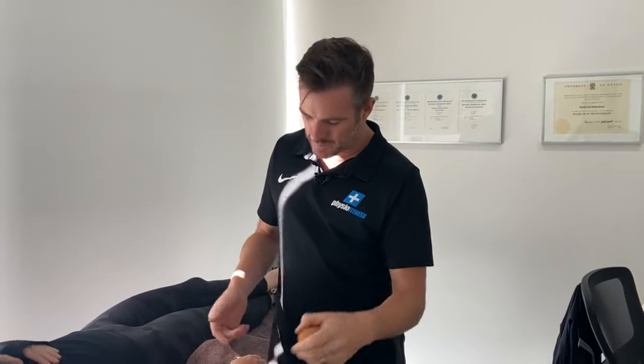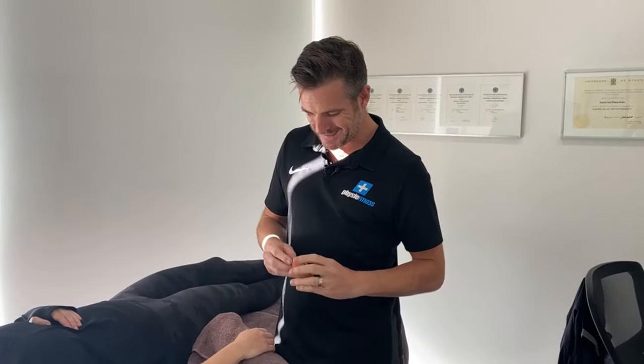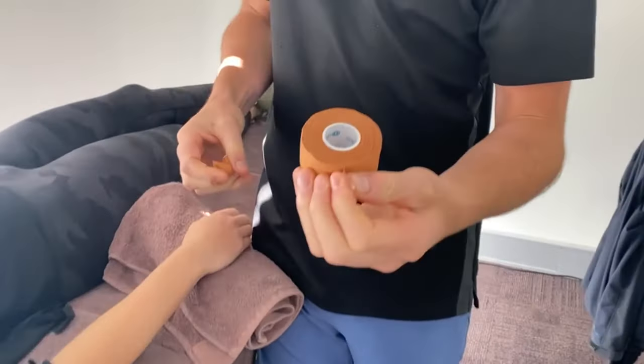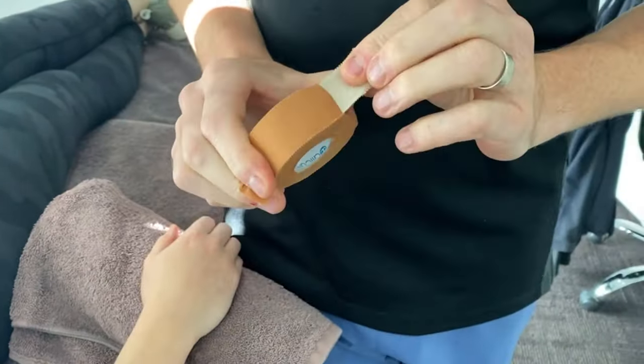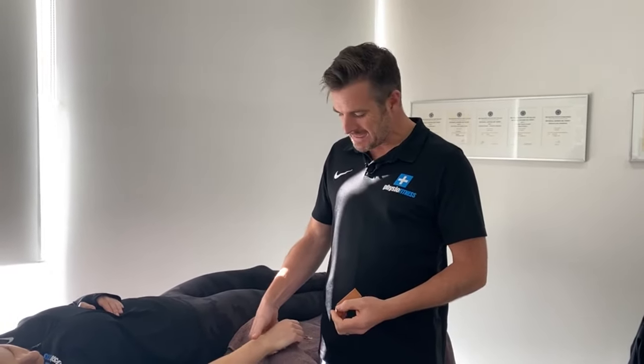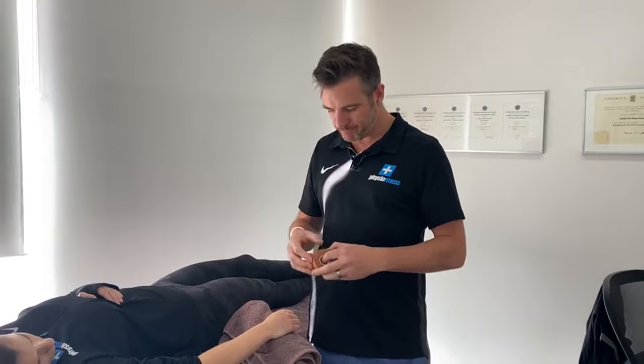We'll start with thumb tape — we call it thumb tape because we use it for thumbs, but it is 25mm tape, not the 38mm wide tape you use for ankles and knees. Make sure it is tearable tape with a serrated edge. This is zinc oxide tape, so it's really sticky and good, but some skins don't like it. If taping for an extended period like three or four days, put underwrap underneath as a barrier to allow some breathability.